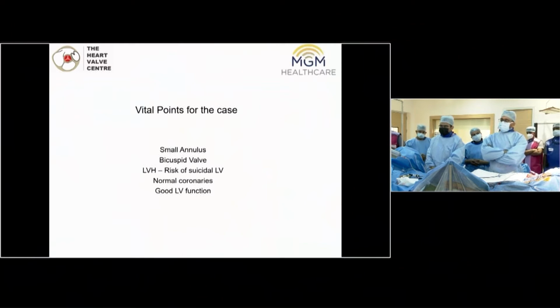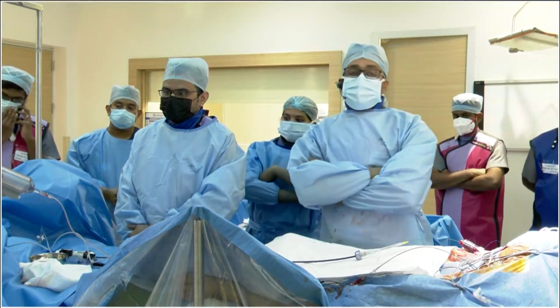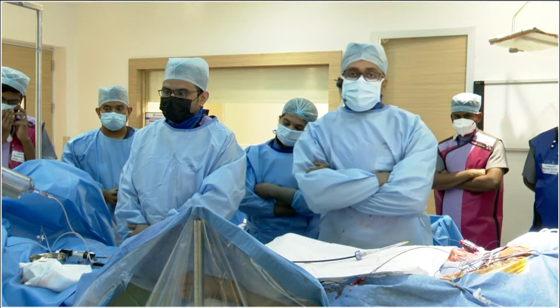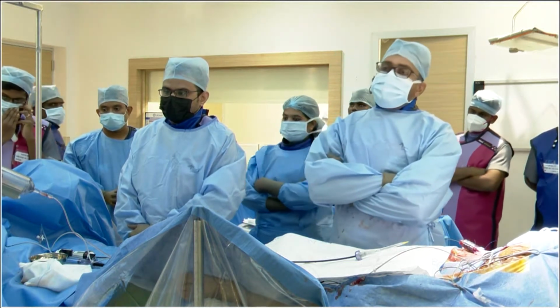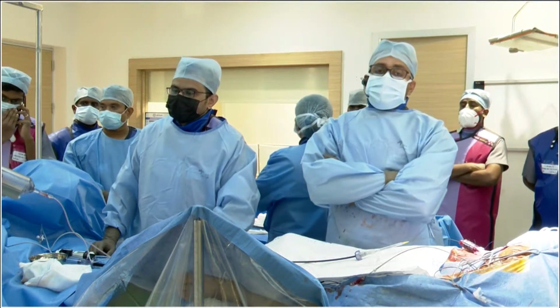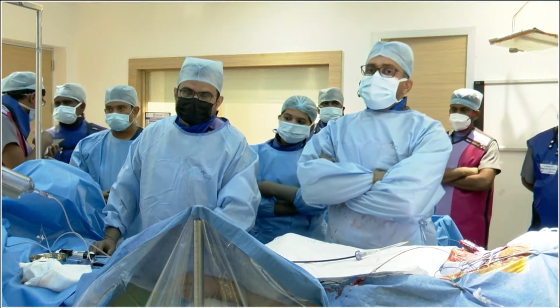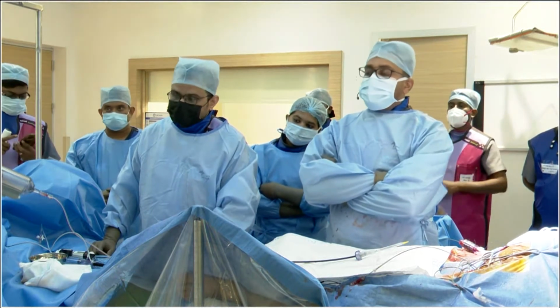She doesn't want surgery. And if we were to do surgery, the plan was to do a root enlargement, because the valve proposed surgically was going to be a 19 or 20 valve, which will give only a 17 or an 18 ID if we don't do a root enlargement. So with all this, and patient preference, which made the decision easy, we have offered TAVR, and that's why we are on the table ready to do a TAVR. That's my presentation. If you have any questions, we can talk about this. Otherwise, we'll do a very quick procedure, and we can talk after.